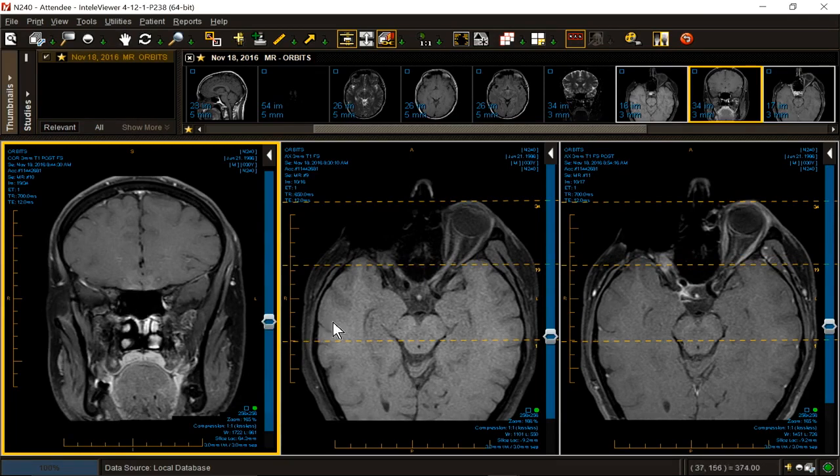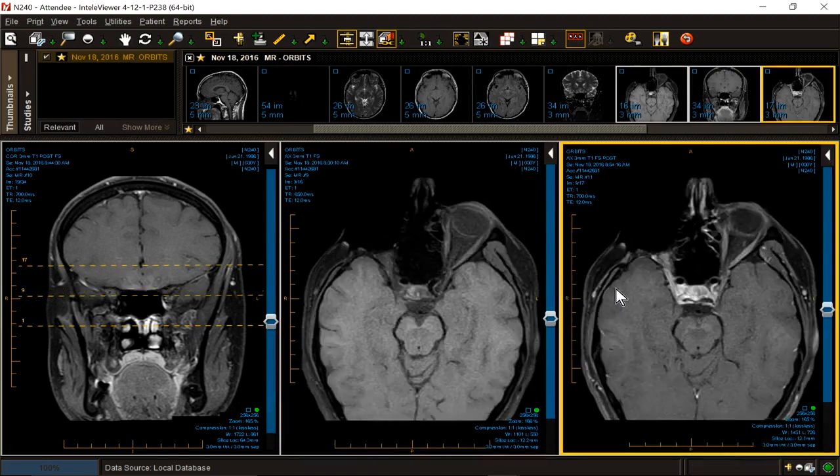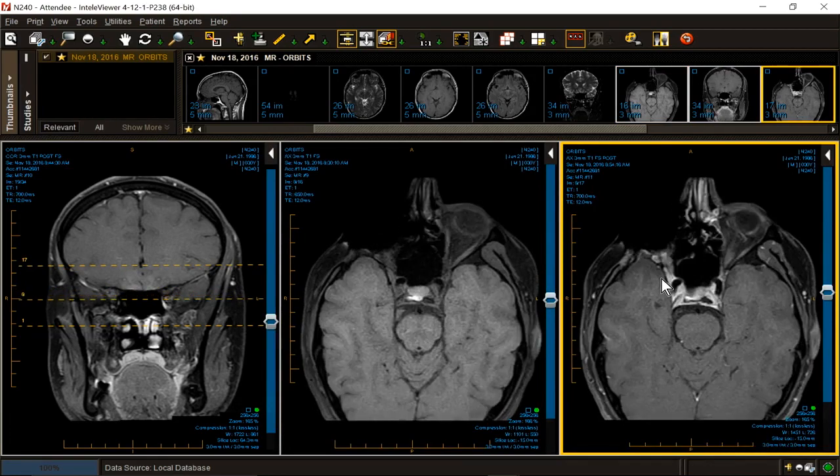So the patient has a known malignant neoplasm, and there is a mass behind our area of artifact. It looks like it's passing along the distribution of the optic nerve, but as we follow it a little more inferiorly, we would posit that the inferior orbital fissure, which is located in this vicinity, is transgressed by this lesion.